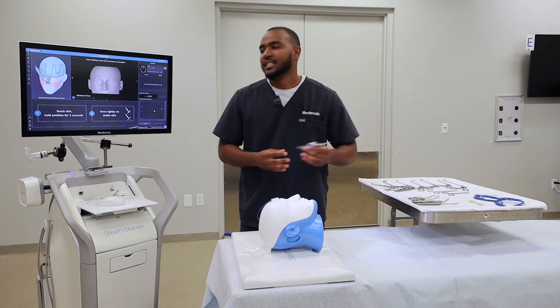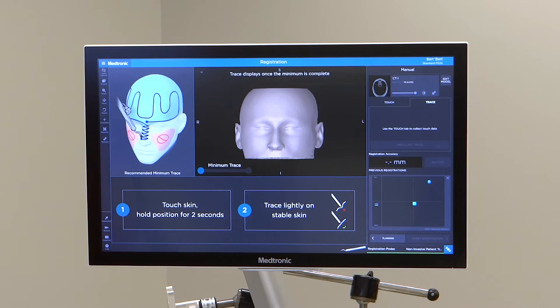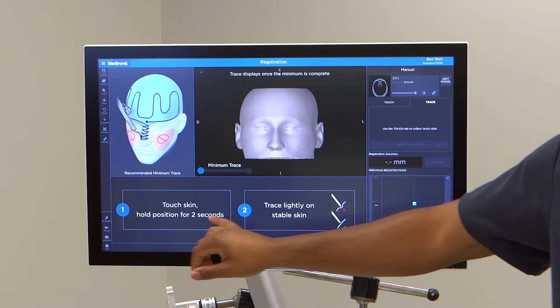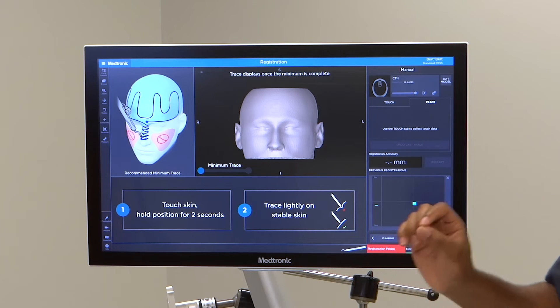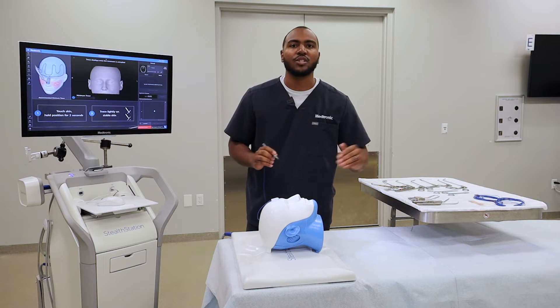To begin registering, follow the first and second steps prompted on screen. For the first step, touch the skin and hold the position for two seconds — by touching, they mean a light touch. After you hear a quick beep, trace lightly on the stable skin. From that point, you'll reach minimum trace and can continue tracing.